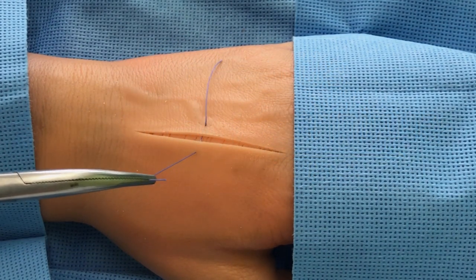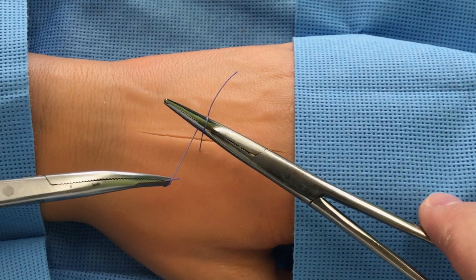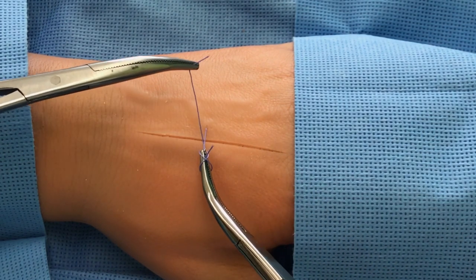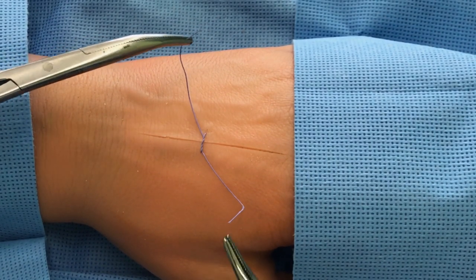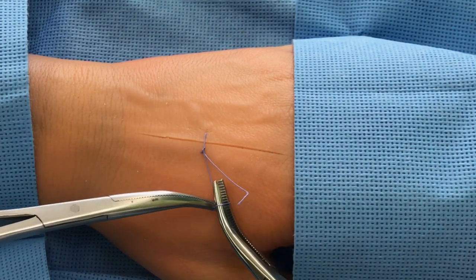The nearest end of the filament is fixed by hemostatic forceps and twisted around closed branches of the second forceps. Further, the distant filament is grasped by the end of the second forceps, the primary loop is formed and tightened.